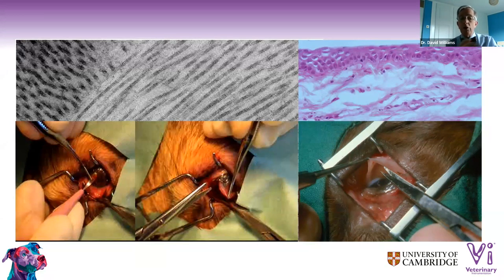Similarly with the cornea. And you can either use, we've got on the left-hand side there, a crescent knife to cut through the layers of the collagen fibrils. And once you've got to the depth you need of collagen fibrils, then just bluntly dissect over, either with a crescent knife. The crescent knife has its cutting edge at the top, so you never go further down. Or you could just use a pair of scissors and undermine through, as we're doing in this situation.